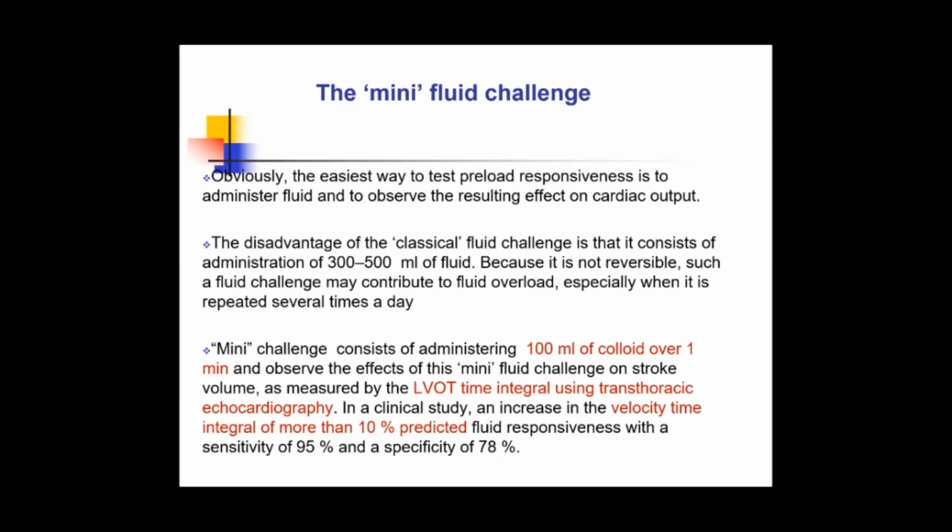So the mini challenge consists of administering 100 ml of colloid over 1 minute and observing the effects of this mini fluid challenge on stroke volume, as measured by the left ventricular outflow tract velocity time integral using transthoracic echo. In a clinical study, an increase in the velocity time integral of more than 10% predicted fluid responsiveness with a sensitivity of 95% and a specificity of 78%.